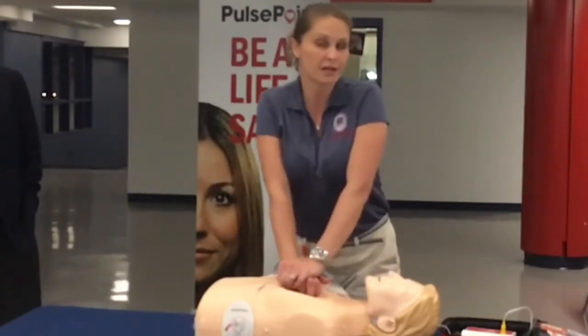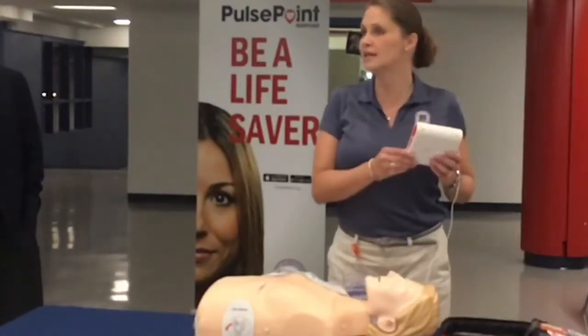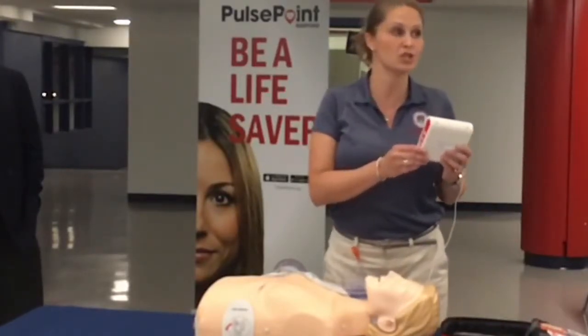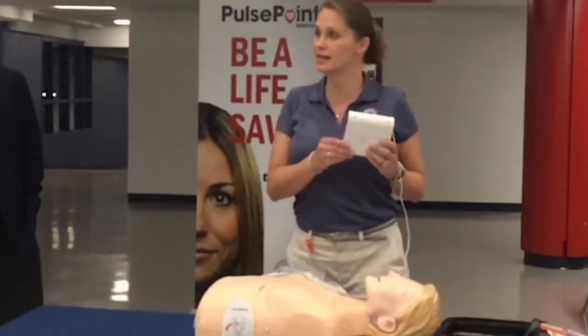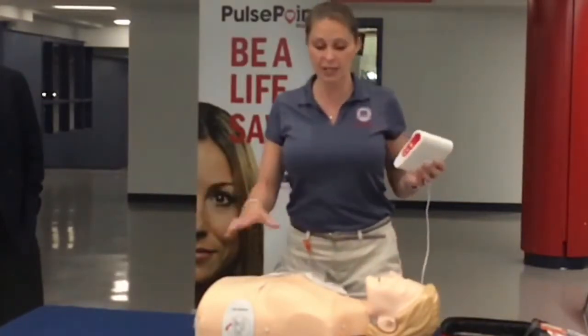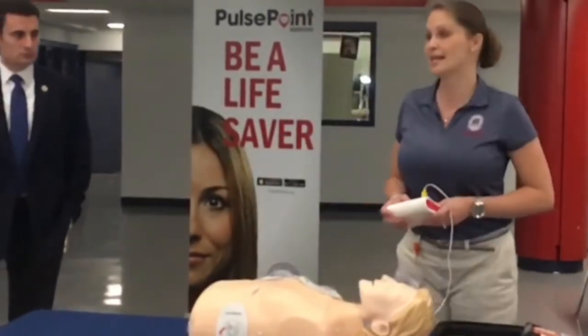What you'll hear is a metronome, and it's going to give you a beat in terms of how fast you should be doing CPR. Then after two minutes, it's going to tell you to stand back. It's going to reanalyze the patient and determine if another shock is needed. It's really as simple as that.